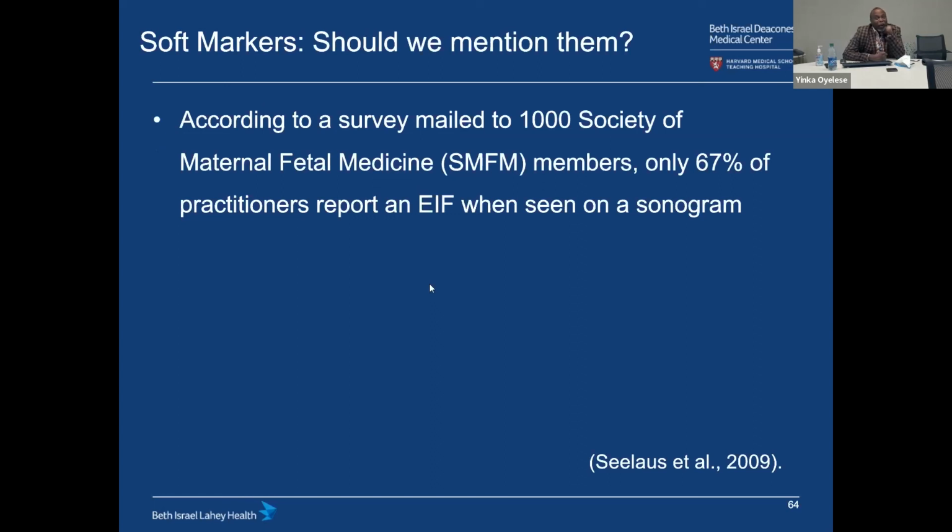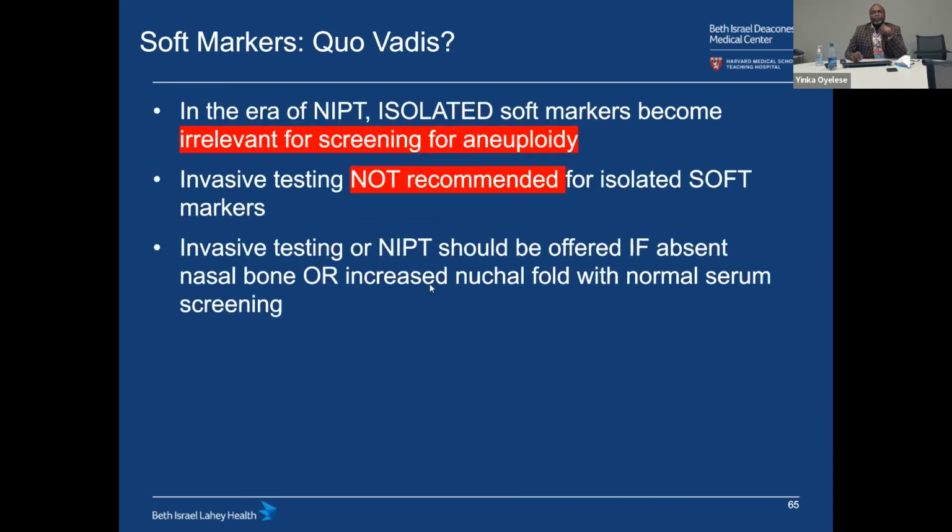So should we mention them? Well, it's interesting that even as far back as 2009, it was noted in a survey of 1,000 SMFM specialists that only 67% reported an EIF. In other words, 33% did not. And this preceded, or was just about the time that non-invasive testing was introduced.